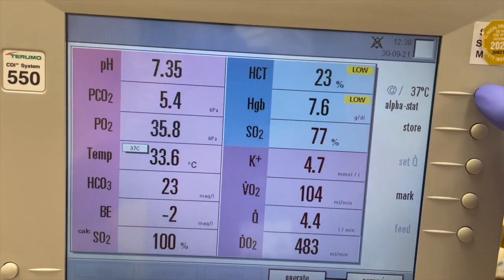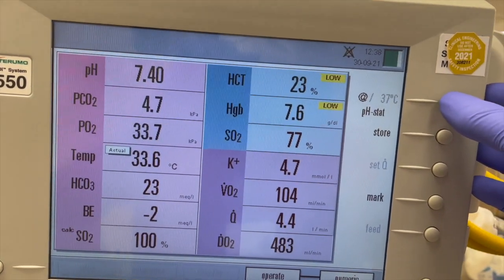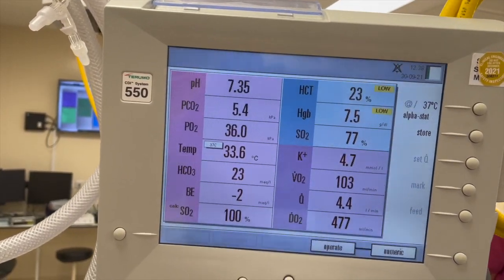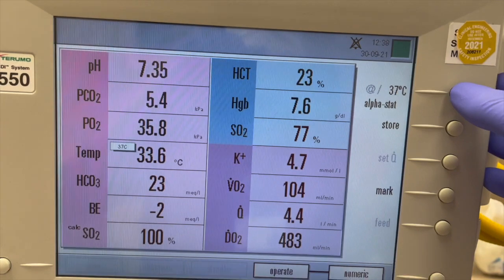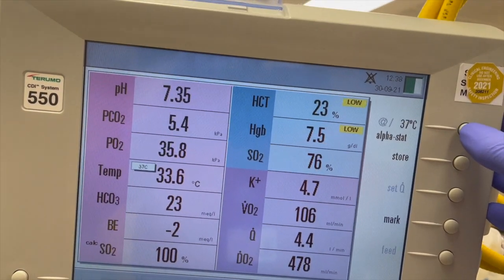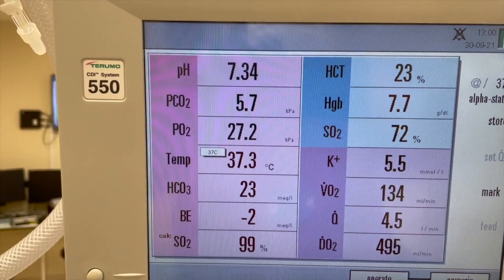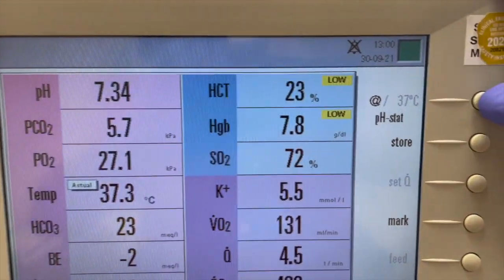CDI is real-time continuous blood gas monitoring, providing early detection of changes in patient status during cardiopulmonary bypass surgery. Access to continuous information is a key advantage in optimum patient management because it enables perfusionists to react without delay. CDI uses optical fluorescence and reflectance technology and continuously measures or calculates critical blood parameter values during cardiopulmonary bypass.